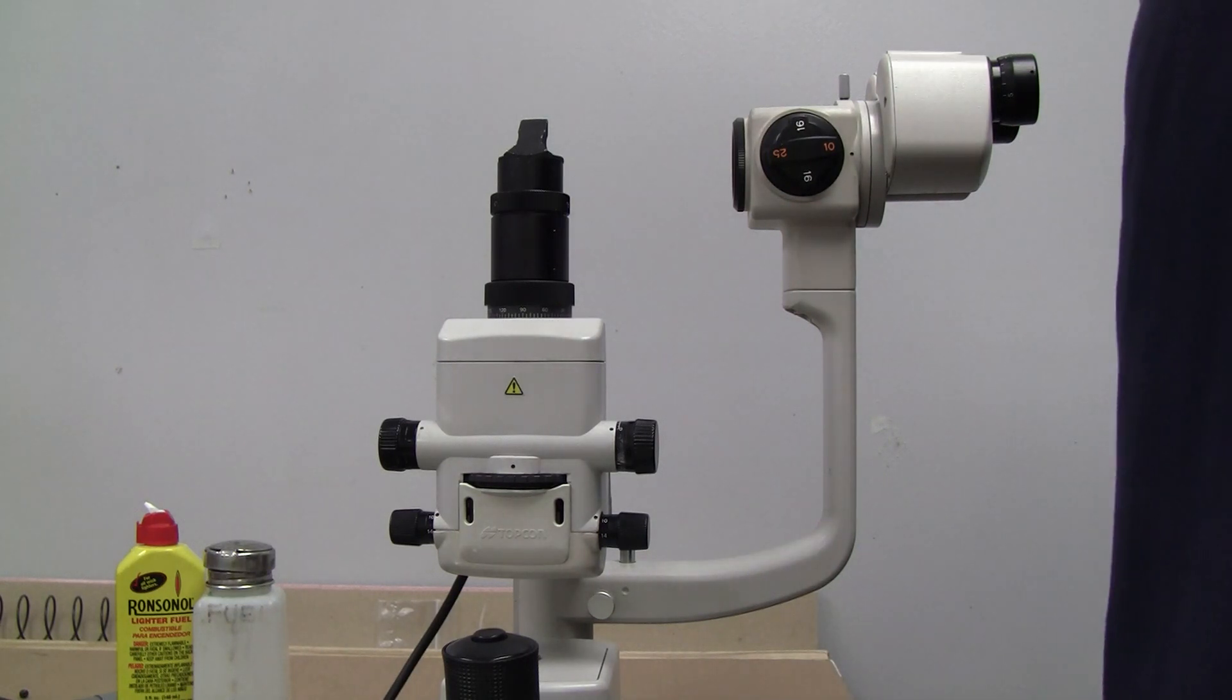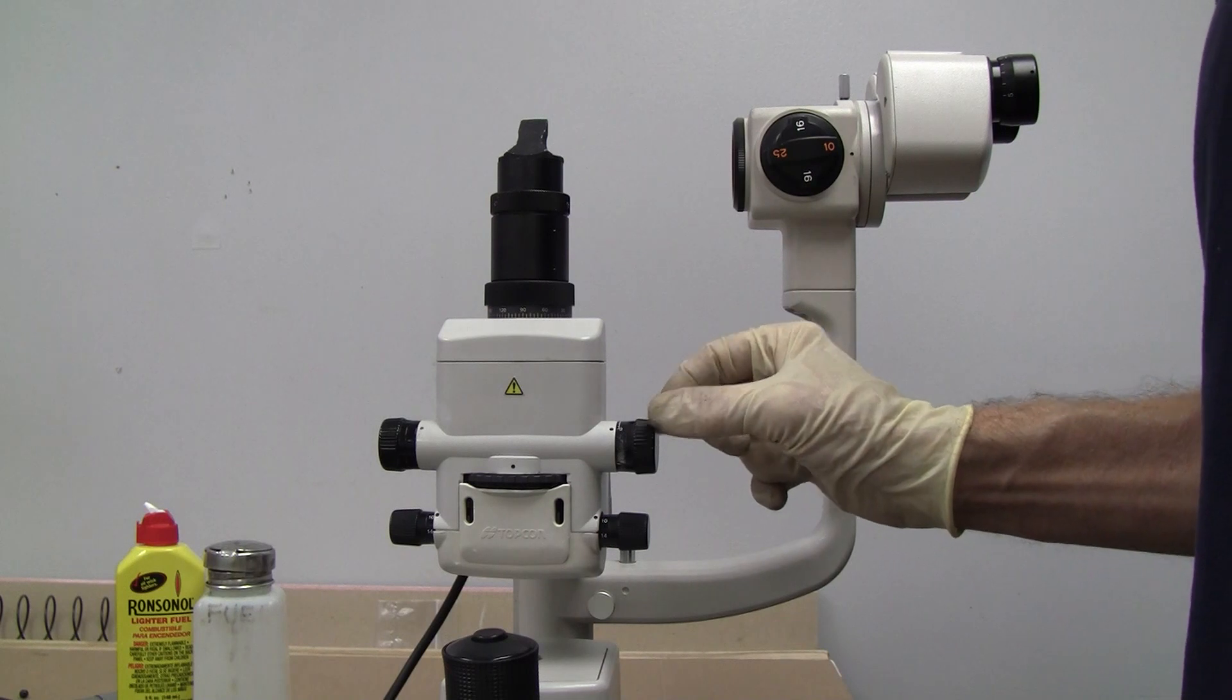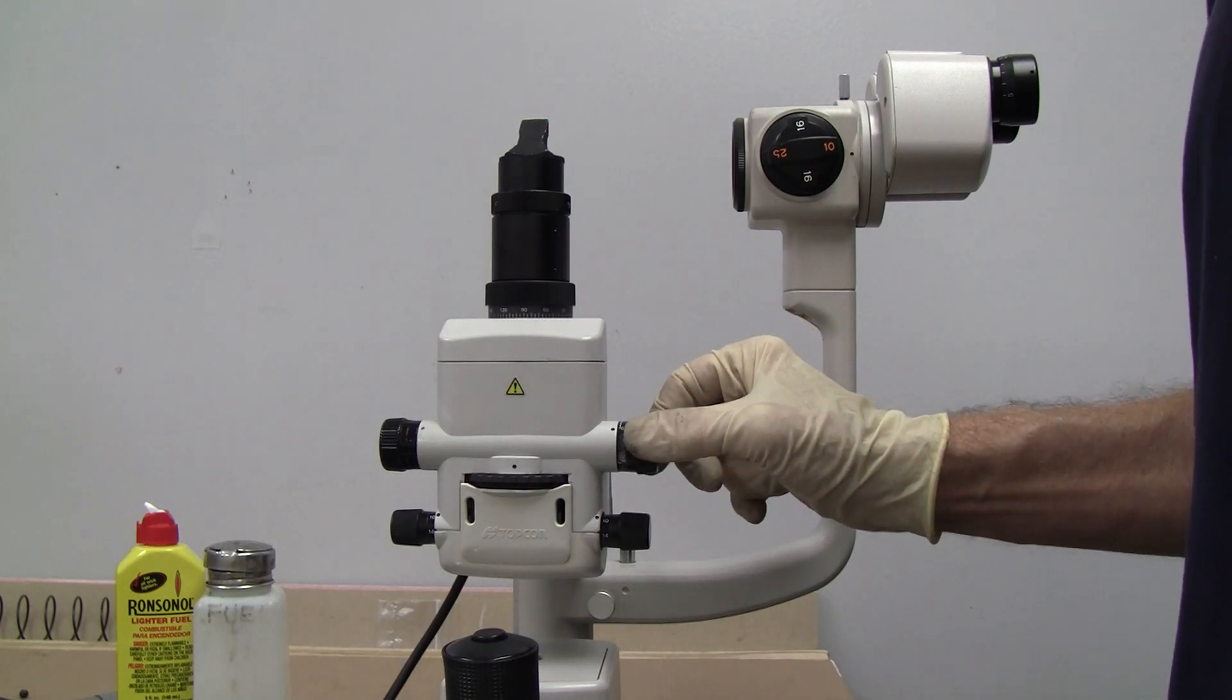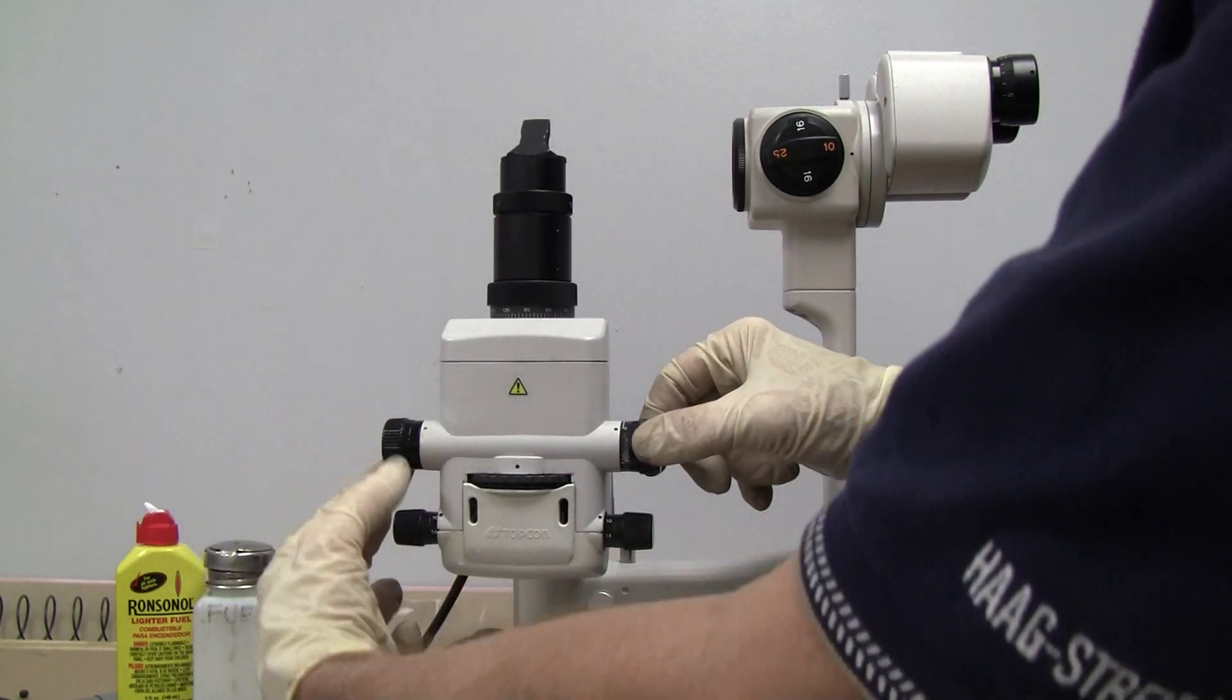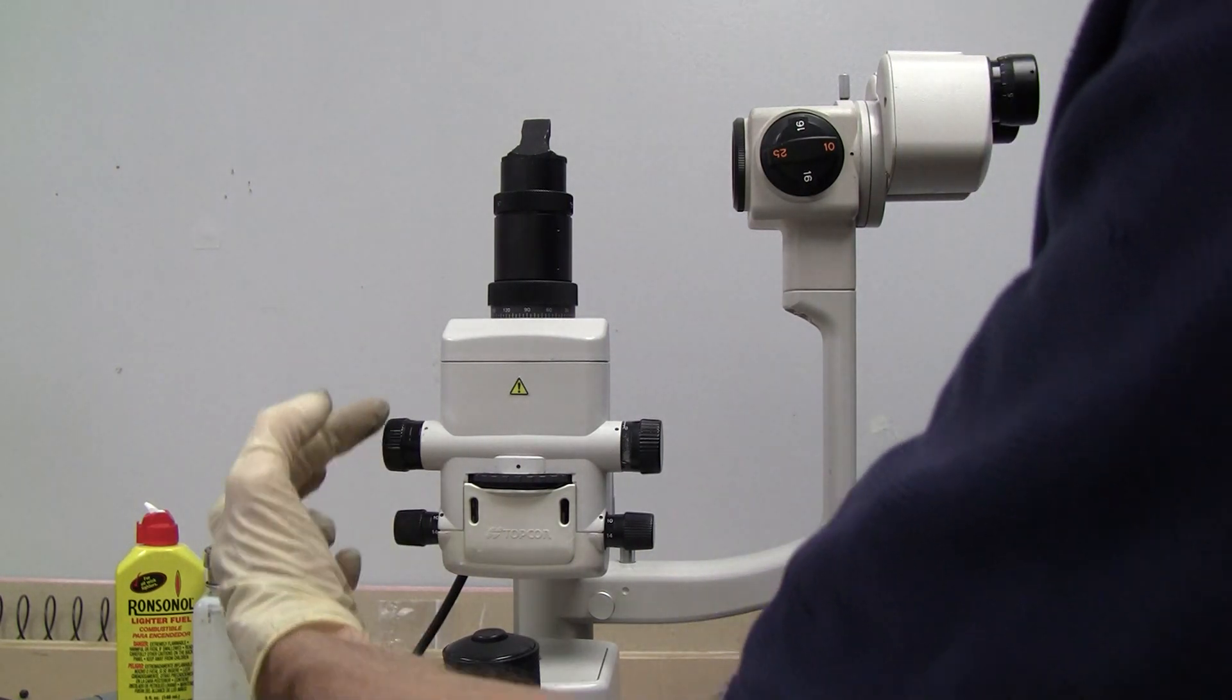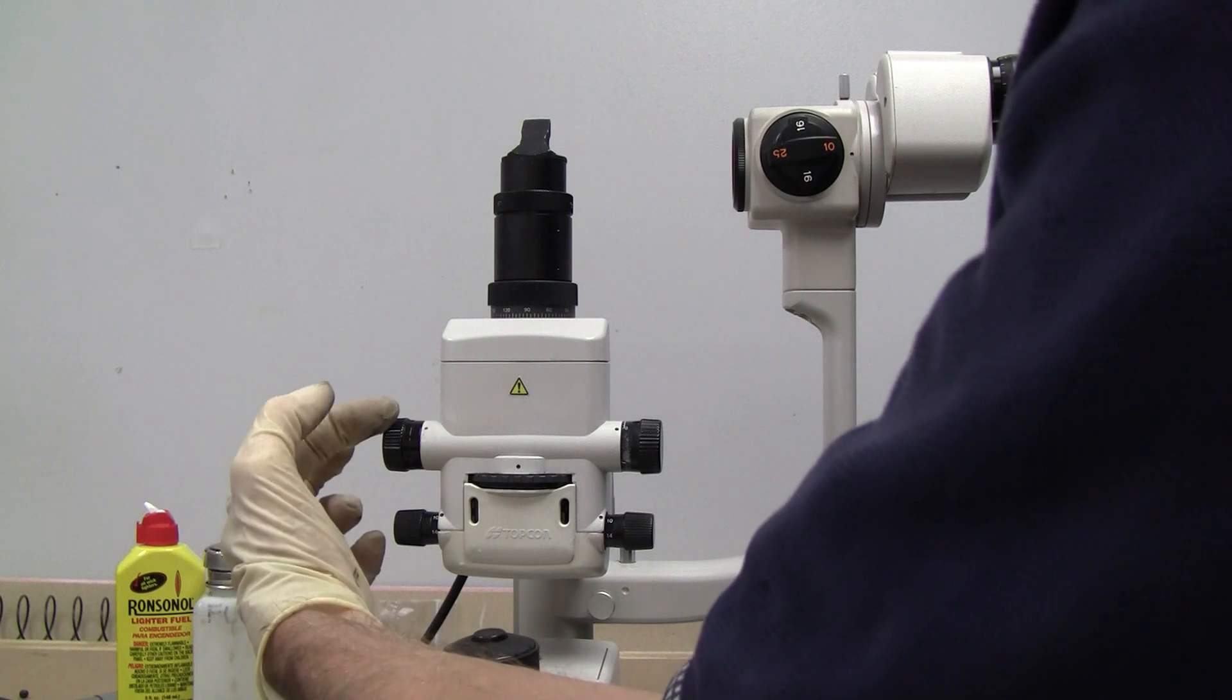On this Topcon D2, there was a previous video where the slit drift adjustment was made by taking off this knob and adjusting the locking nut, tightening it and putting it back on to get more tension to keep the slits from closing.